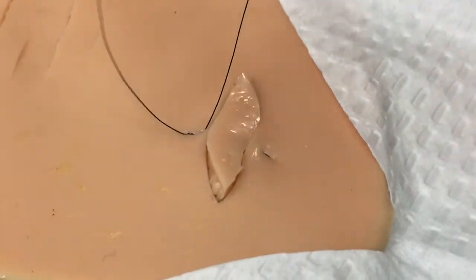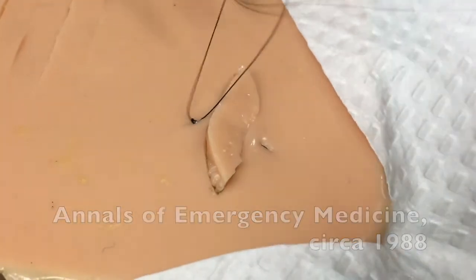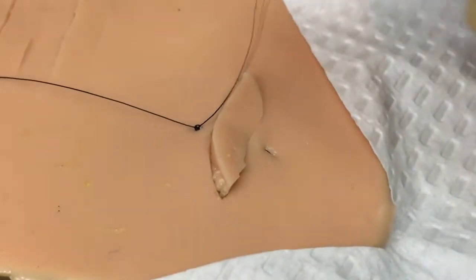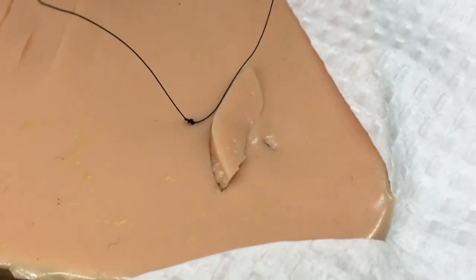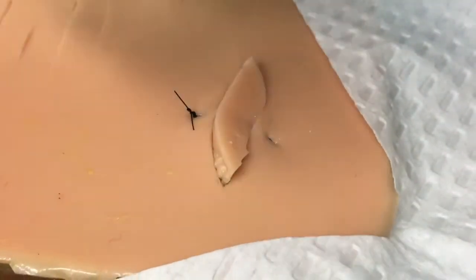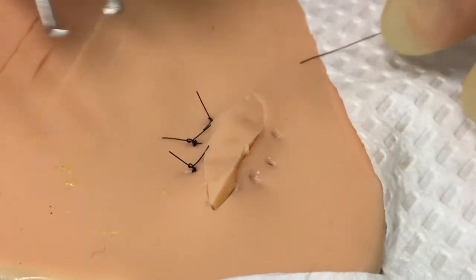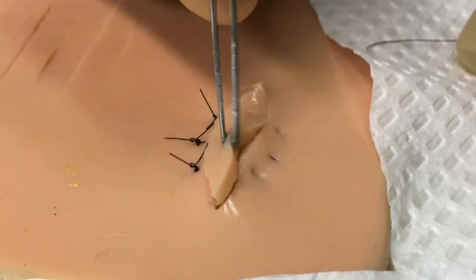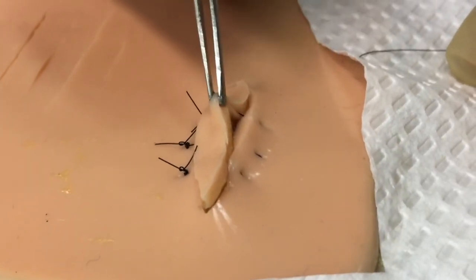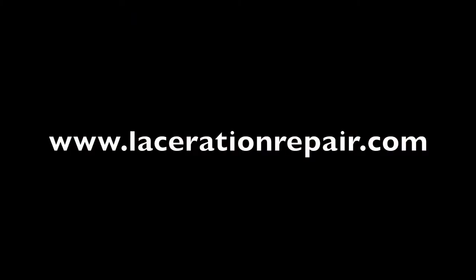This technique was first described in a letter in the Annals of Emergency Medicine in 1988 by Dr. Daniel Sammo. Several other techniques for closure of parallel lacerations are also described both in my blog post and in an accompanying video. As you'll see, multiple sutures of this style can be placed in order to firmly attach that evulsed tissue island back within the wound bed. To learn more about this technique and other techniques in basic and advanced wound repair, be sure to visit www.lacerationrepair.com.